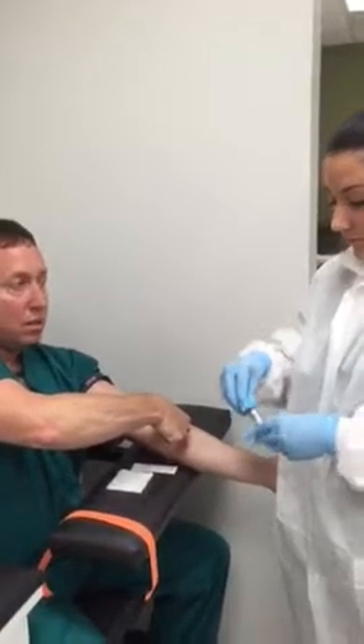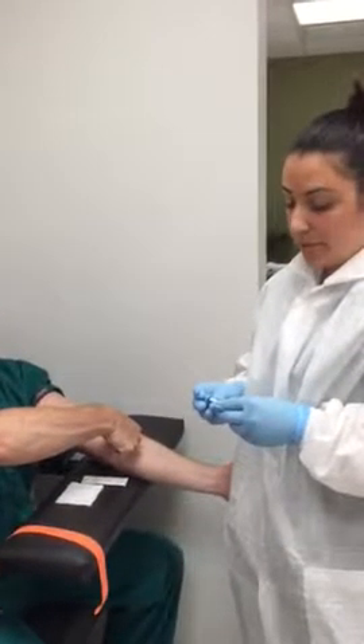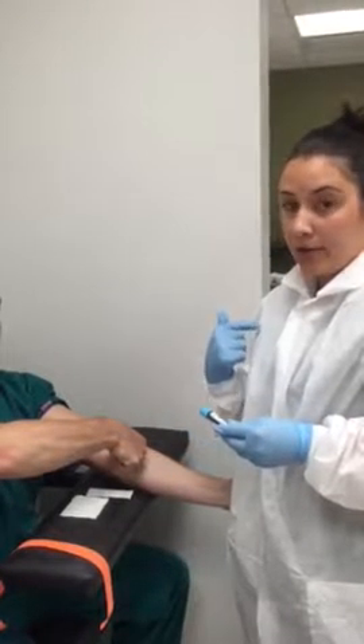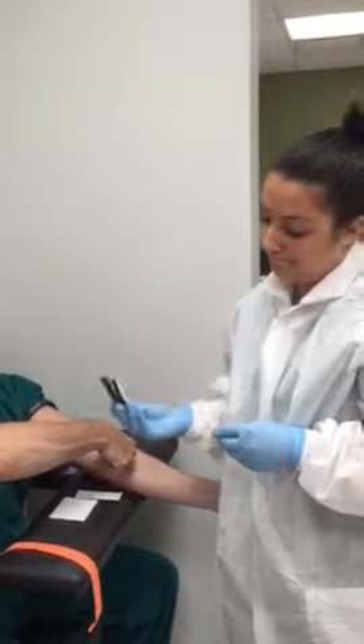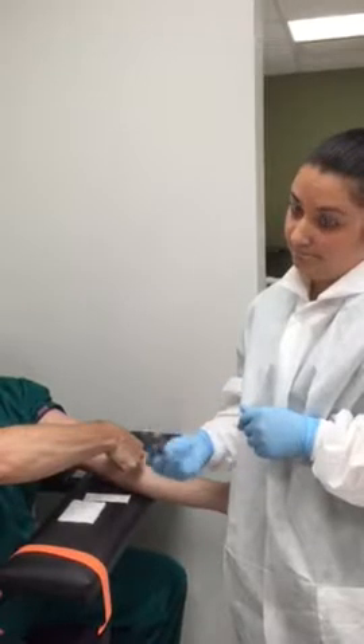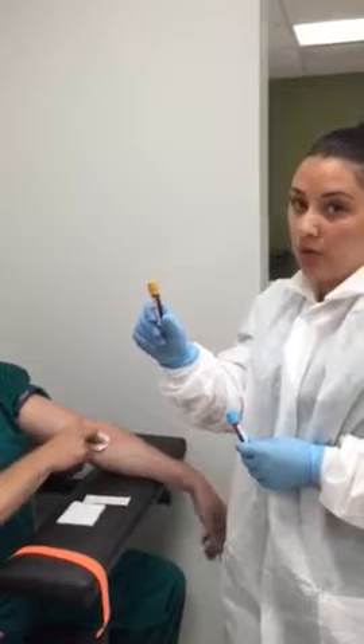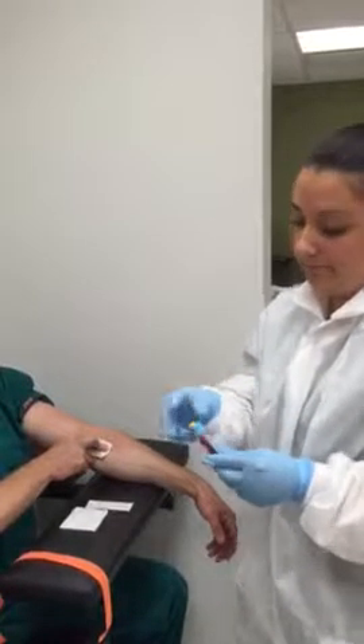So what goes on the tubes, Noelle? I'm going to put the patient's name, date of birth, their patient ID number, my initials, and the date and time. And where do you deliver them to? The light blue cap one is going to go to COAG, and this gold top is going to go to the chemistry department. Excellent.